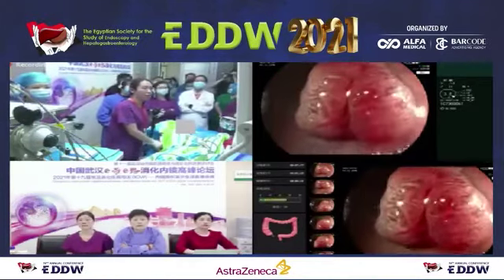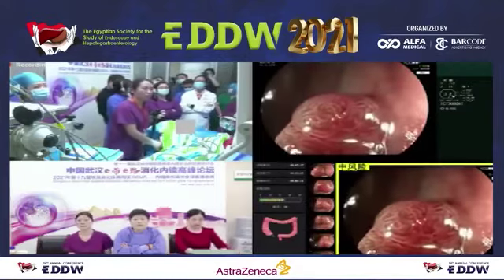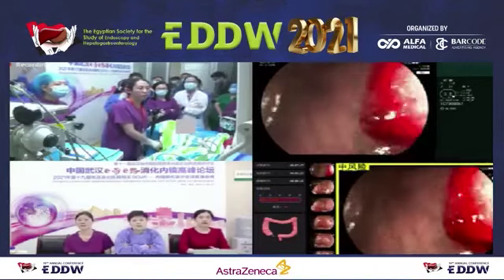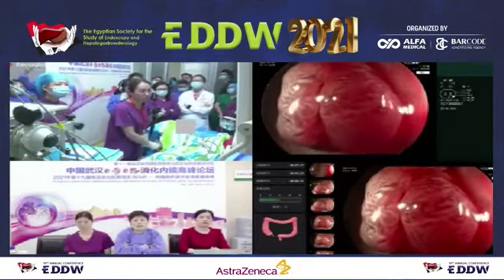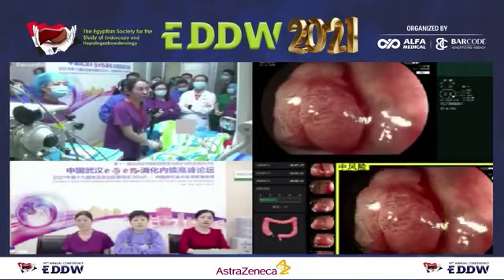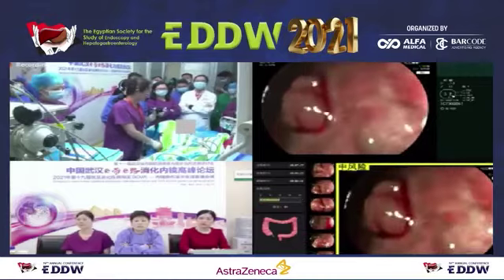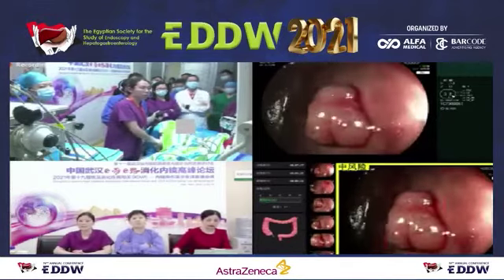So the shape of the pit is like a brain. What is the pit classification? 3L. So it is adenoma. Okay, let's go.